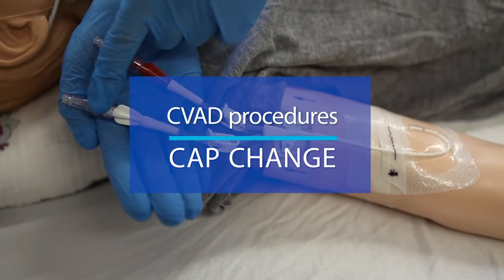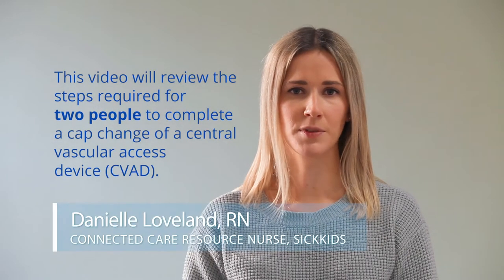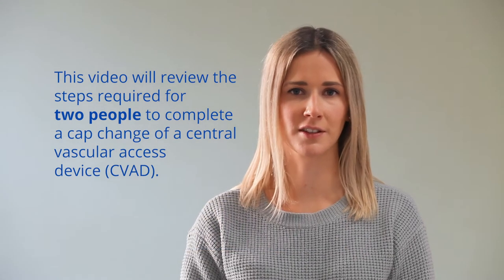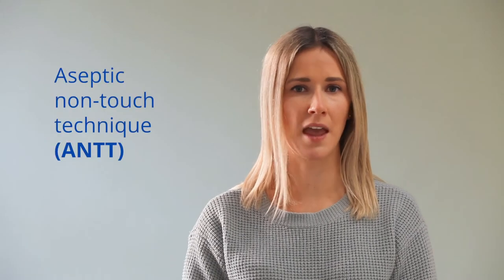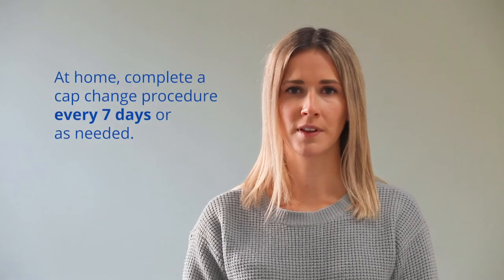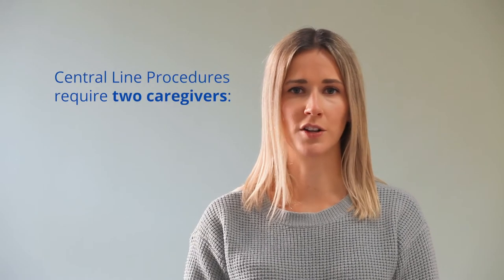Central line procedures: cap change. This video will review the steps required for two people to complete a cap change of a central vascular access device, or CVAD. It is important to remember that this procedure uses aseptic non-touch technique, or ANTT. At home, this should be completed every seven days or as needed.